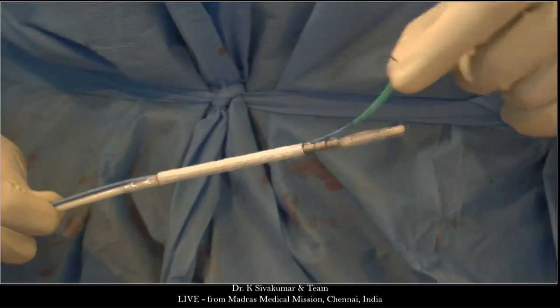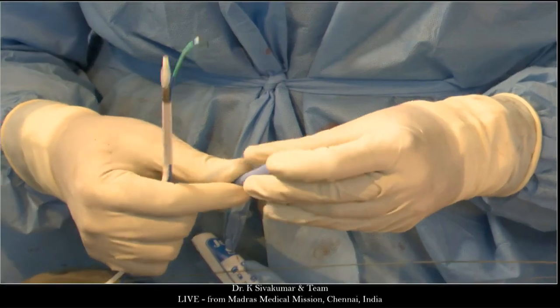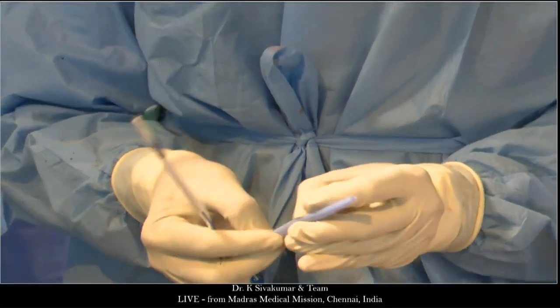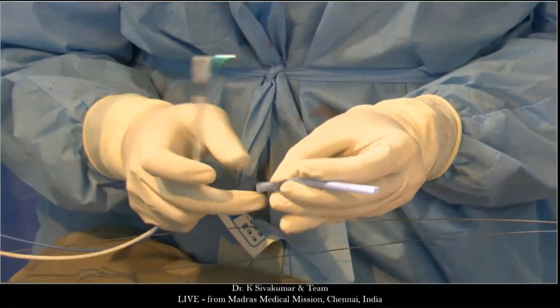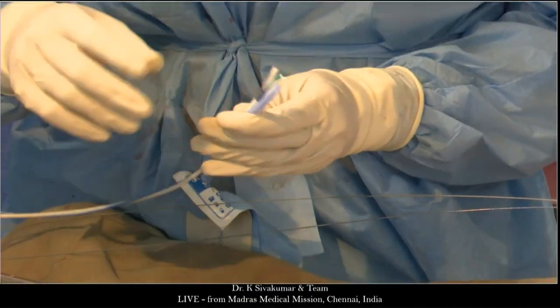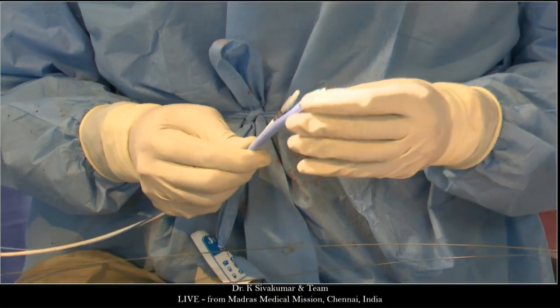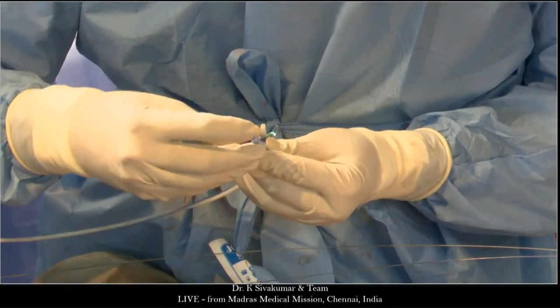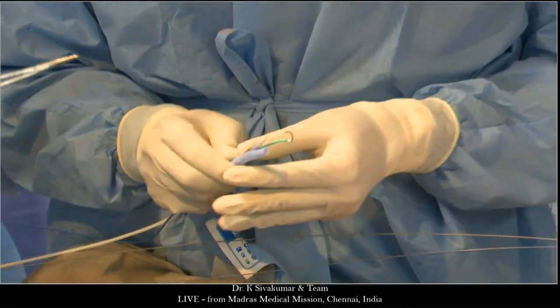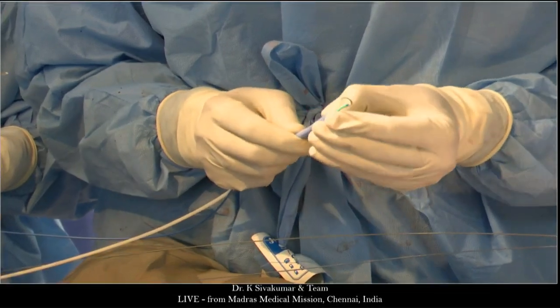Yes, sure. So right now what I'm going to do is, I need a protective sleeve. So I have taken an 18 French sleeve, I have slit it longitudinally, now I'm going to cover it. Can you see that? I am slitting it, because this is now going to be much larger in its profile than what I anticipate. That's why I think it's better to use the dry seal sheath because you don't have a valve. It will go in without any problem. But that's what I told you this morning, India has not registered Gore products. I understand.